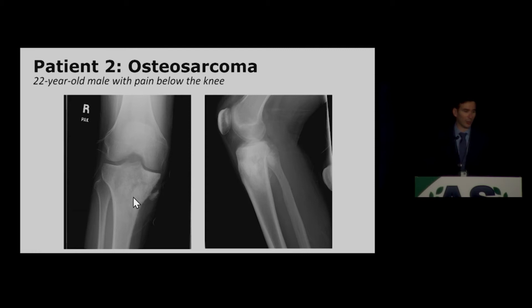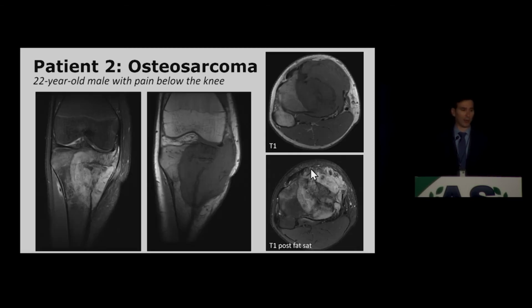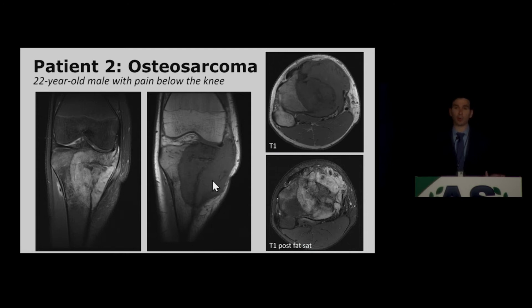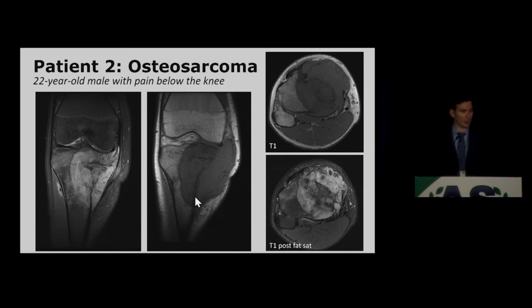Patient 2 is an osteosarcoma. You can see this ill-defined lytic and sclerotic lesion with loss of cortex and new bone formation — almost a hair-on-end periosteal reaction both medially and dorsally. These lesions require further imaging for workup and treatment. On MRI, there is high T2 signal and low T1 signal; solid components enhance, and small regions of low signal represent a combination of bone and blood products. This tumor extended into the joint space, and the patient was treated with a limb-sparing complete arthroplasty and long-segment reconstruction.